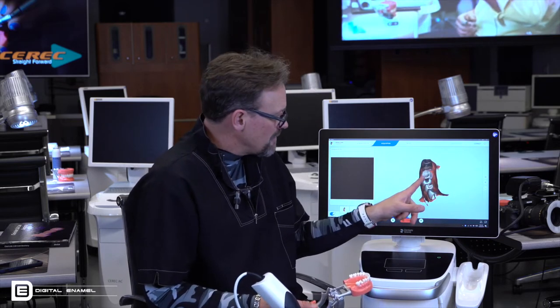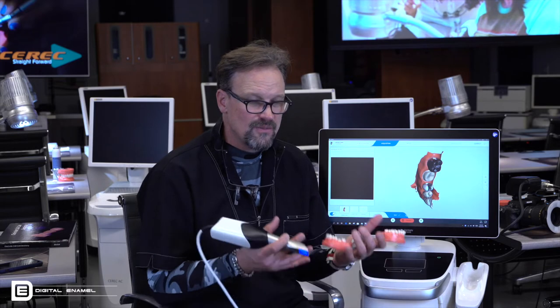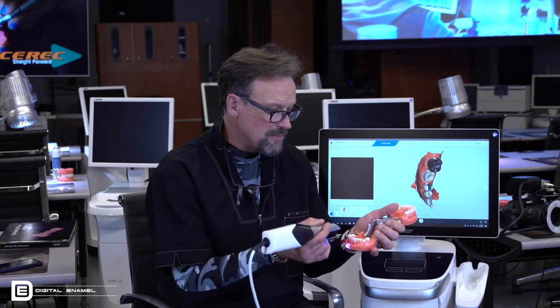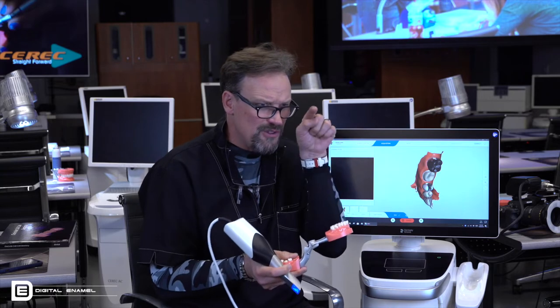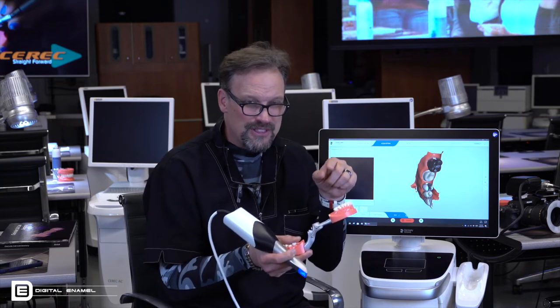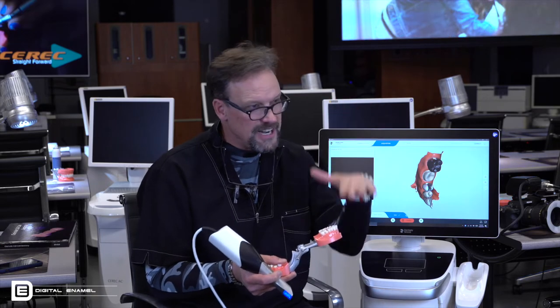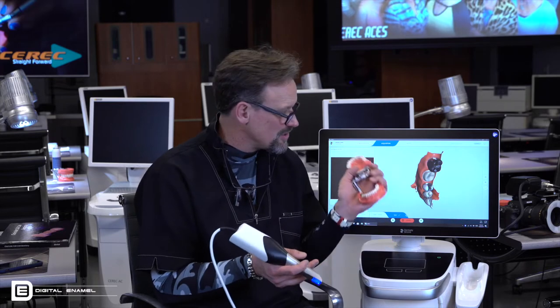Stop and evaluate. Now I've got the distal of this premolar to do, but I've seen this so many times, and getting more data doesn't help the program the way this happens. So the human, as we're using the camera, we're like, fill in that hole, fill in that hole, fill in that hole. But the entire rectangle is just getting more and more data on top of data on top of data. And you're just building your file size for it to start slowing down on a simple restoration.